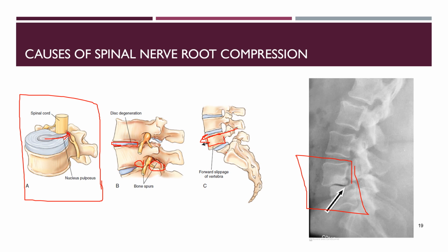And we're going to see when we look at our contraindications, any type of cervical or lumbar instability is a contraindication. There are different grades of spondylolisthesis, so there are certain grades that people will still use traction with, like if it's less severe, they may perform traction to just decrease this compression of the spinal nerve root. But in my eyes, that's a little risky to me. It's already hypermobile, and we're going to distract the joint, possibly causing more instability or hypermobility.